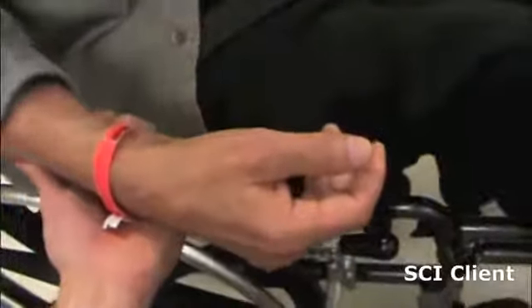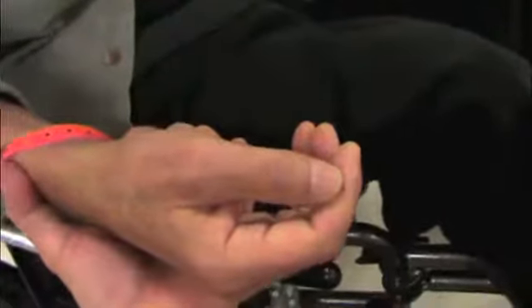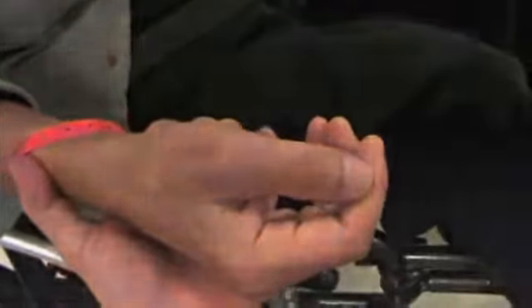Here is an example of a spinal cord injury client. Not only does he lack finger flexion, but also has no extension. The glove combined with electrical stimulation would be recommended.